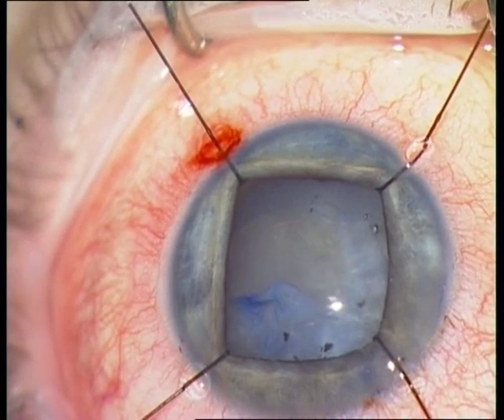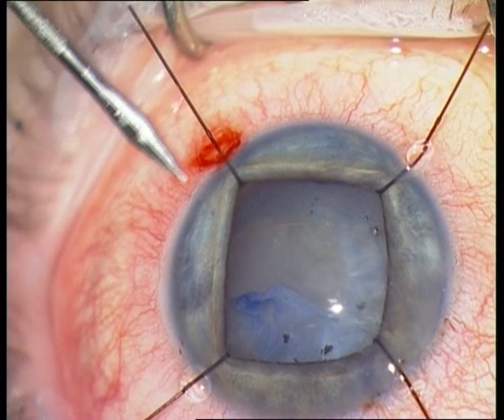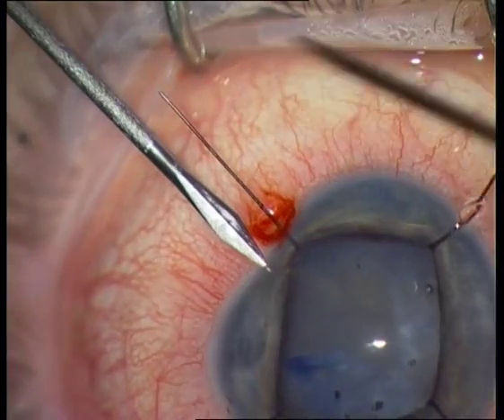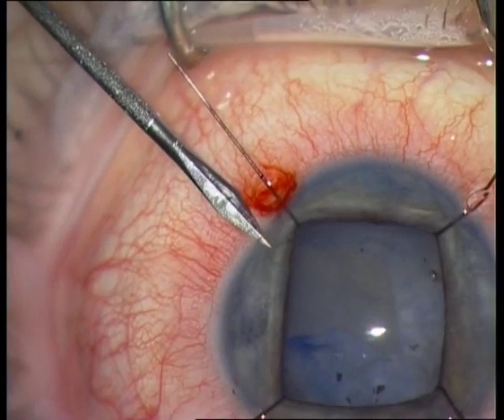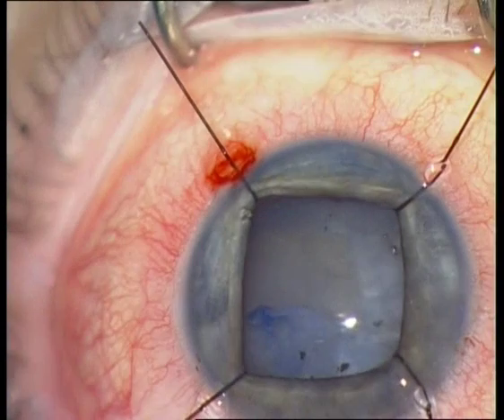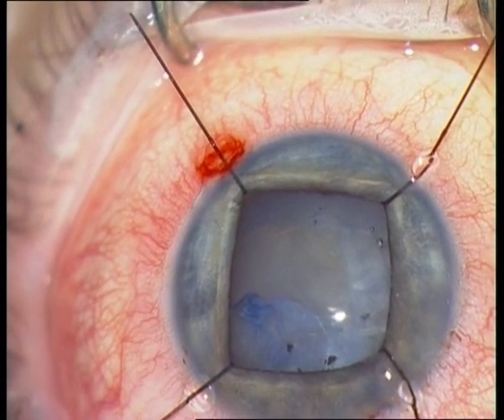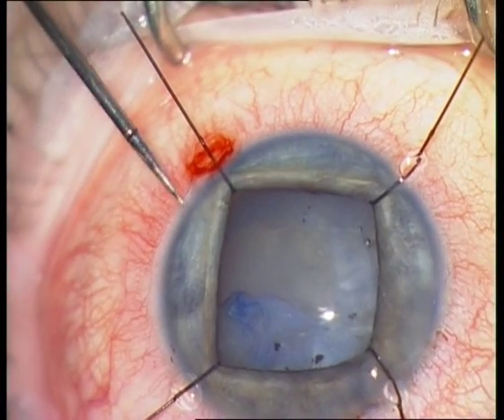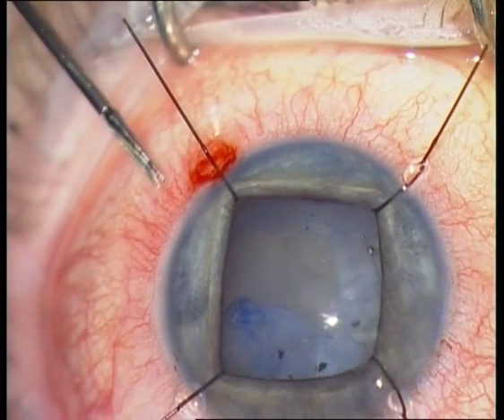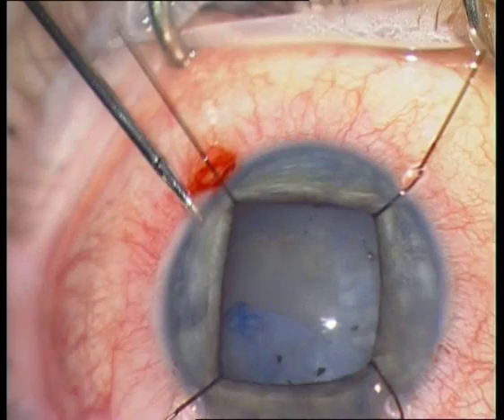It is important that you must be a bit flexible with the scissors — I am using them from different locations — in order to perform a round, circular rhexis. I am continuing now from 5 o'clock to continue the rhexis.